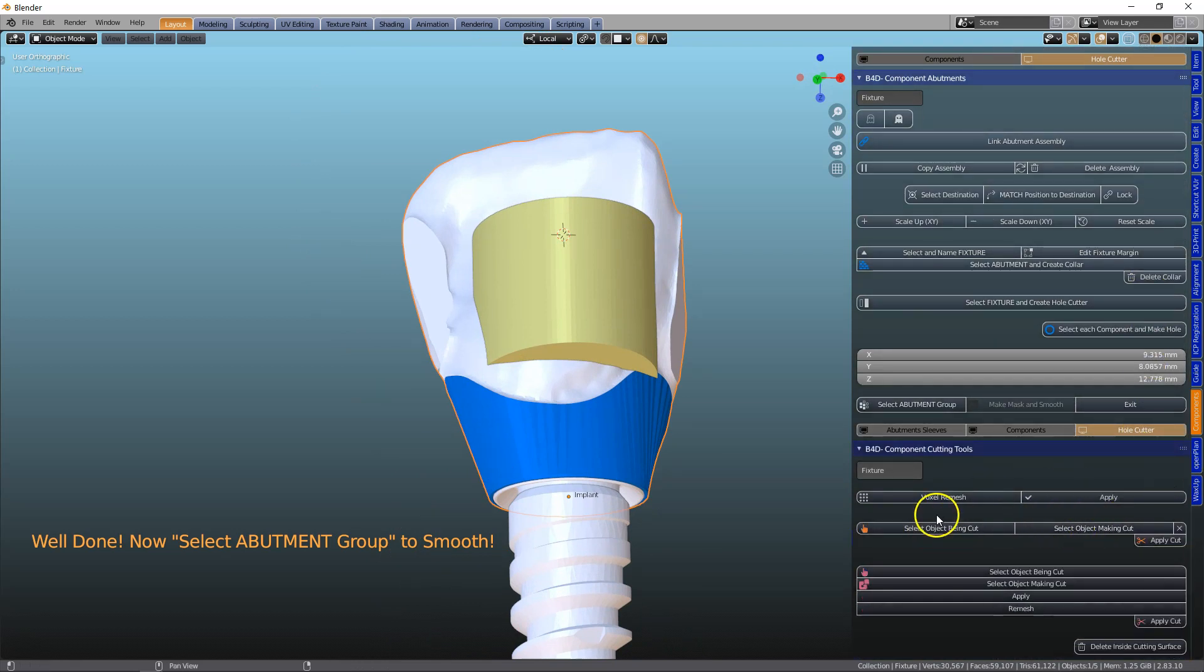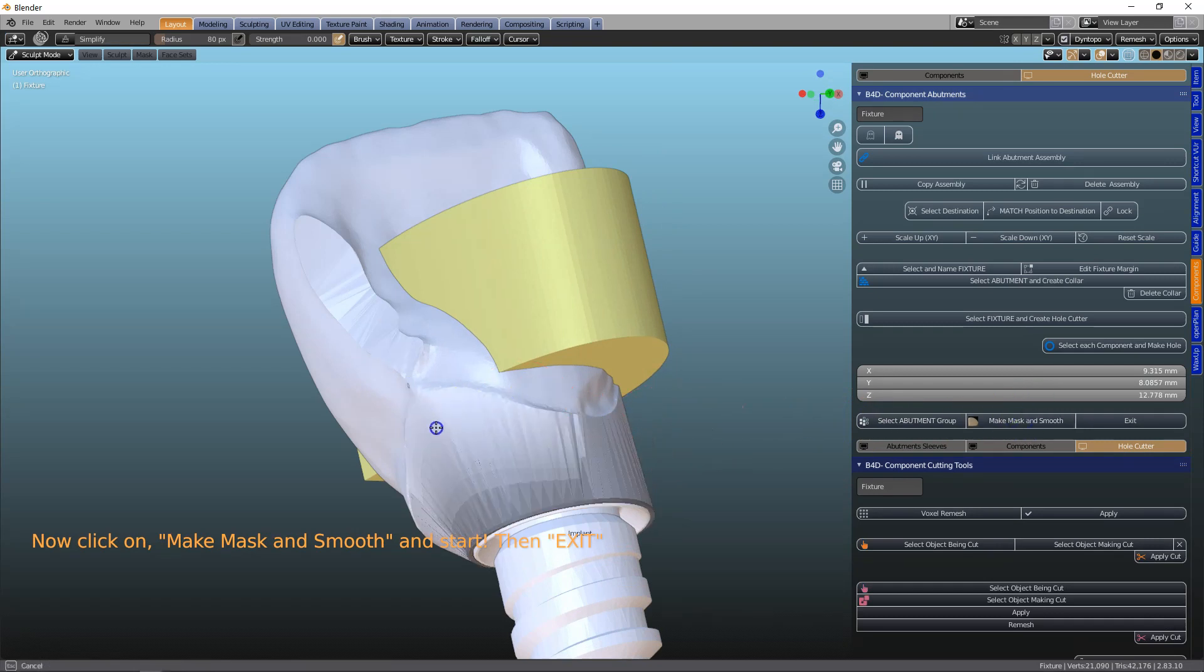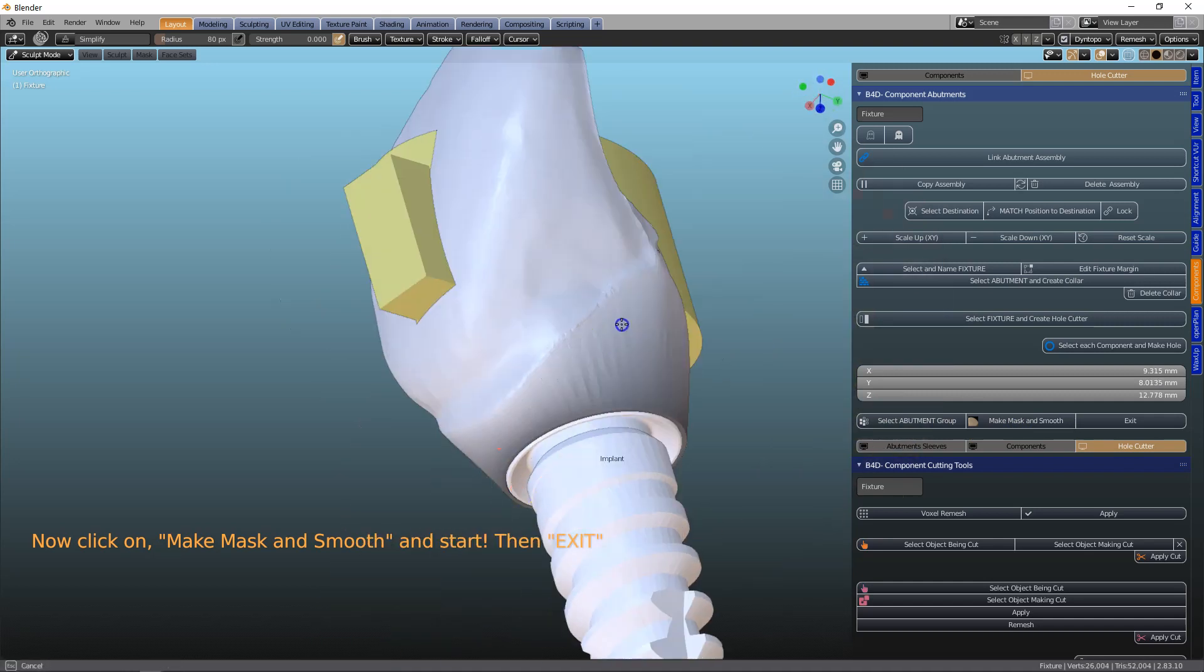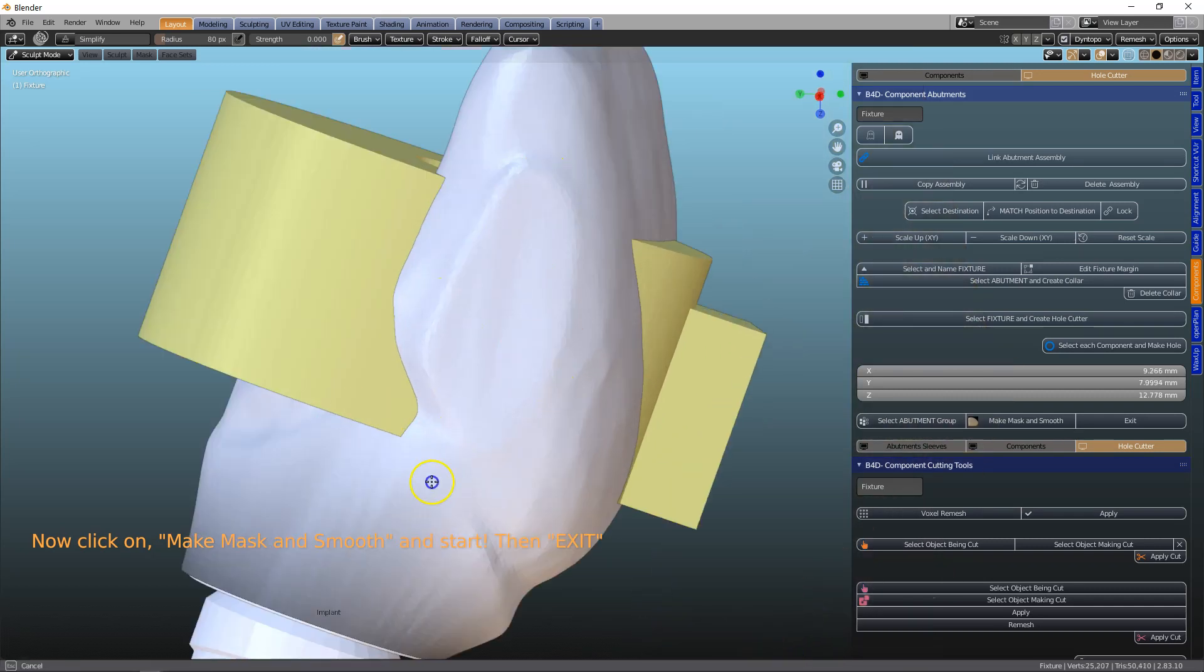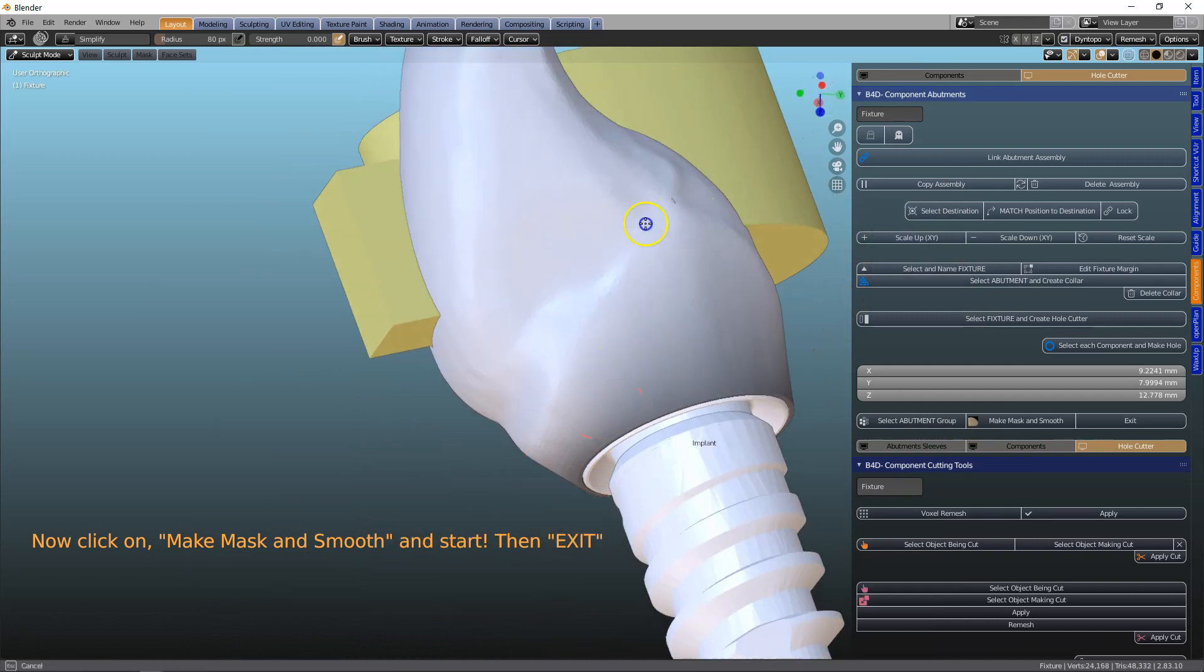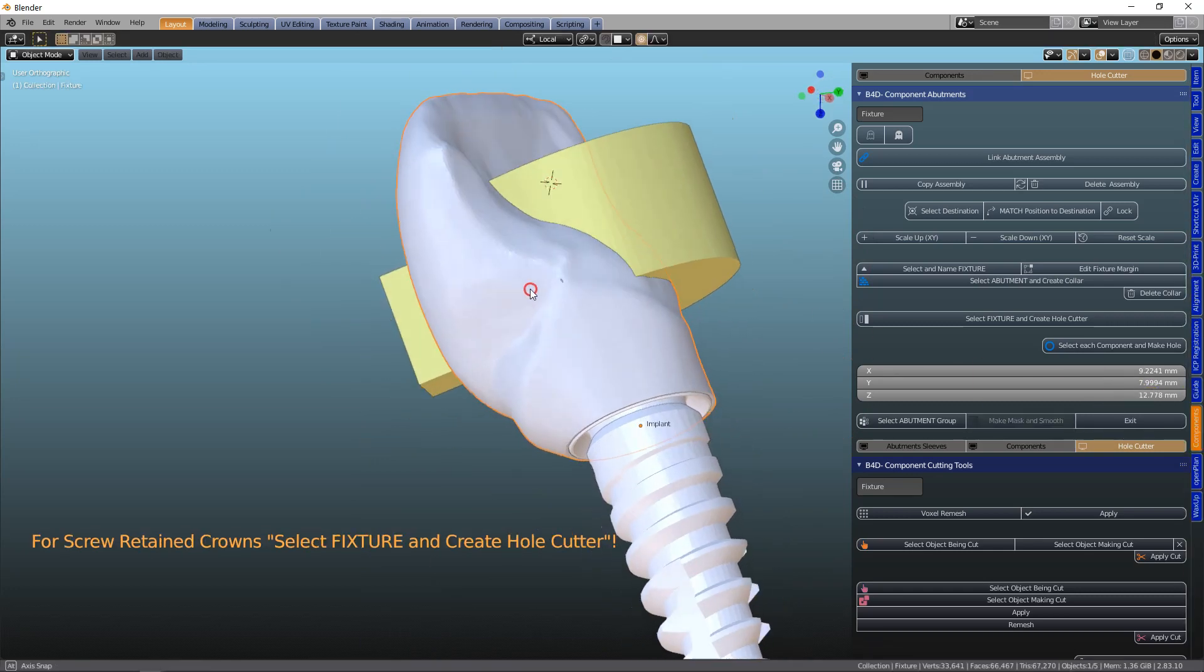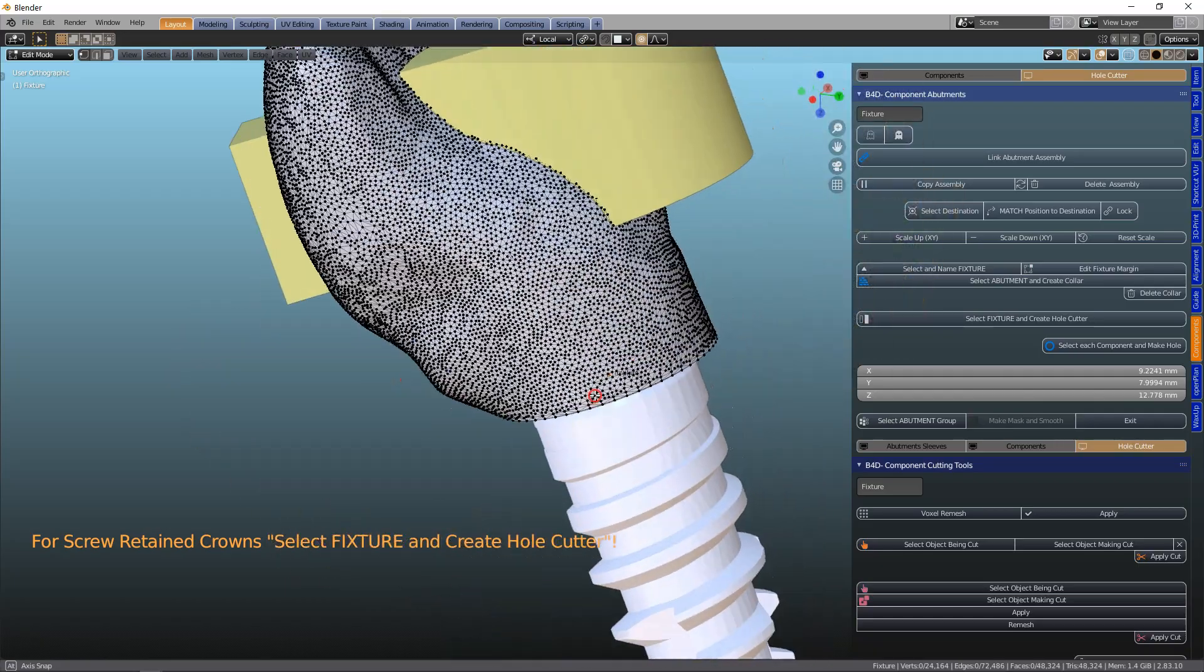And we want to of course smooth it a little bit. So we're going to select our abutment group and we're going to make a mask. And we'll smooth this tooth down a little bit. We could have hidden the yellow sleeve, but let's just continue. I do want to have a screw retained implant. So we're going to be focusing on that. And in edit mode we can see we've got a beautiful mesh.